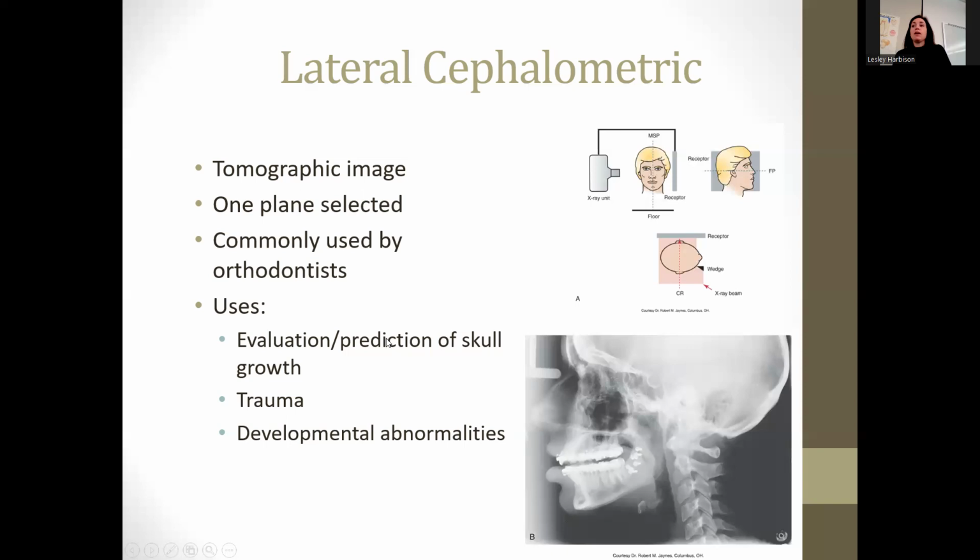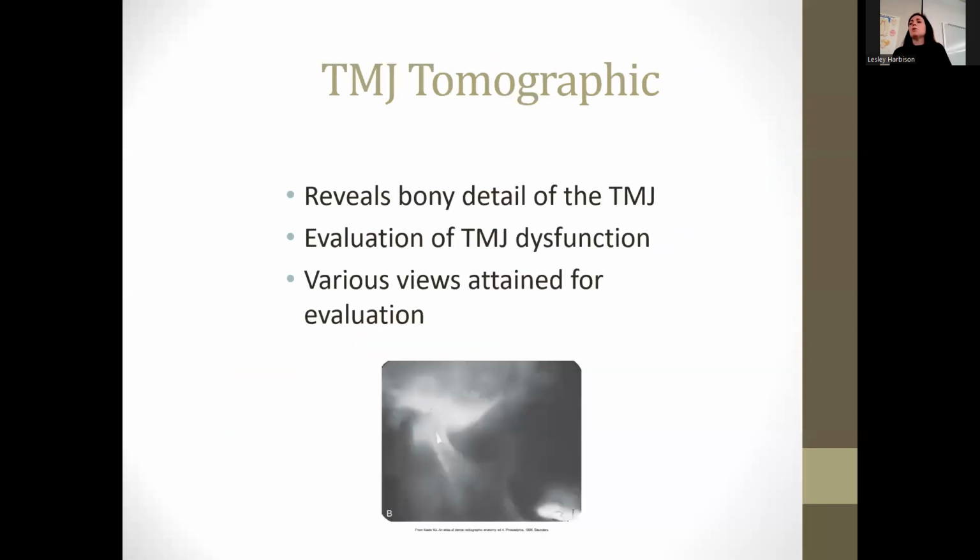It's a 2D image commonly used by orthodontists to evaluate growth patterns, trauma, if there was some trauma, and developmental abnormalities. So they may use this maybe before and after orthodontic treatment. I'm not sure. I never worked for an orthodontist before, but that's who would mostly use it.